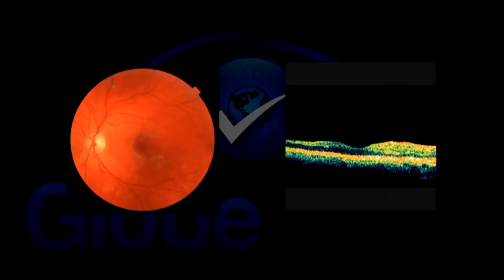Another patient here has a normal looking fundus photograph. We look over here and we see retinal thinning on one side. This patient had a branch retinal artery occlusion, and after the acute event, you're not really going to see the pathology. You're going to look and see a normal retina. But without visual acuity, we don't know that this patient is seeing 20/200, has no central vision. We're just looking at a photograph. Looks normal.